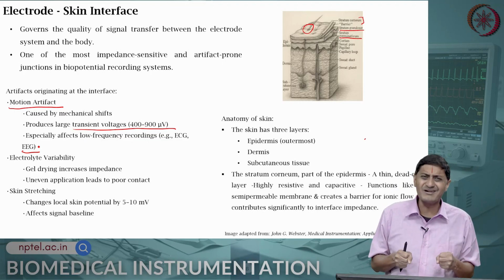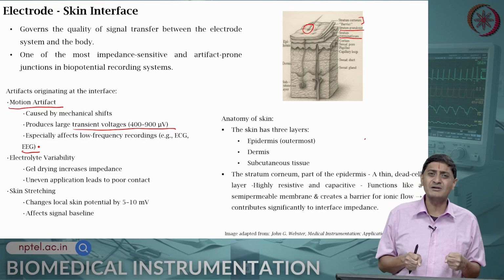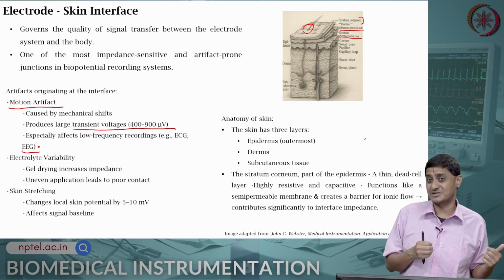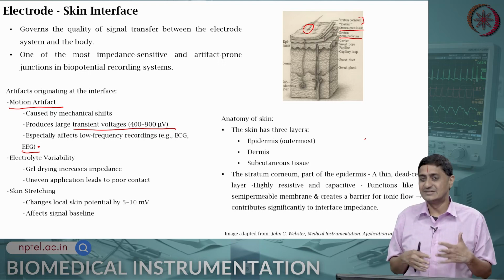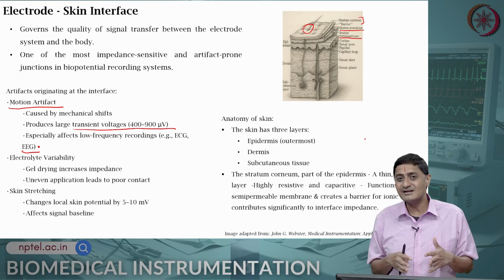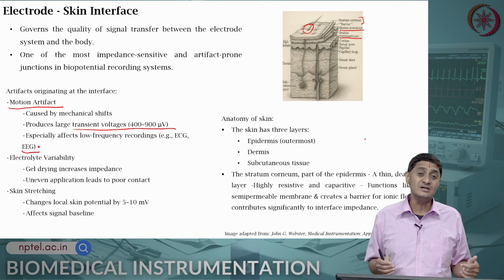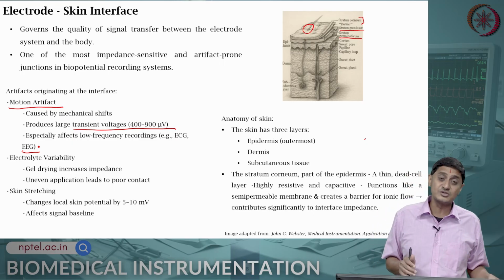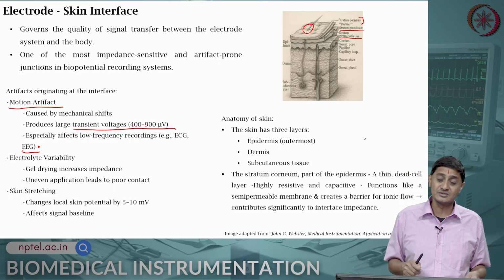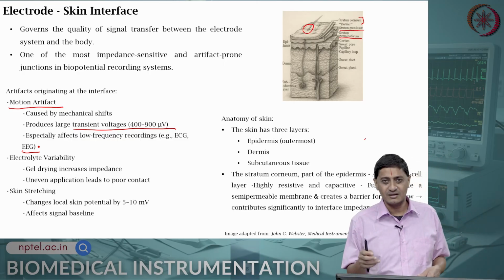Sometimes pressing it hard might be a good solution from a recording perspective, but might not be good from a patient comfort perspective. As a clinical biomedical engineer, it is important for you to design things that do not harm patients, right. So, patient comfort also needs to be considered as you are making sure that the electrode does not move.